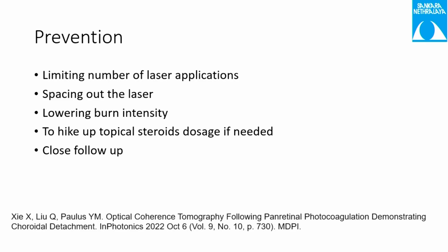And whenever you suspect the patient requires a greater number of burns in a single setting, try to increase the steroid in that same setting, so that the inflammation induced by the laser can be counteracted by the topical steroids. And of course, whenever we are going for an aggressive kind of treatment, it's better to follow up these patients on a little closer watch.